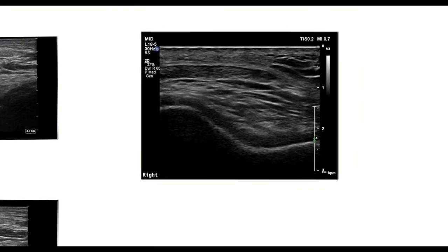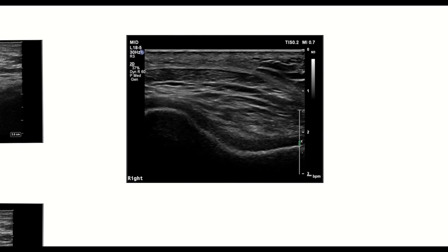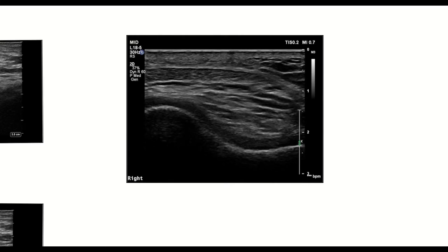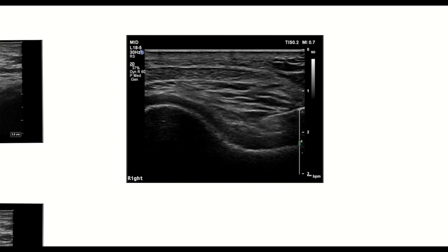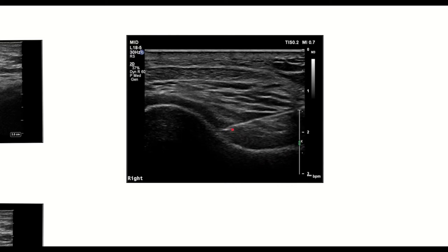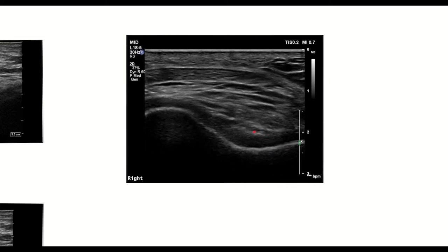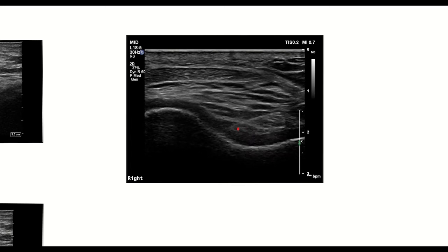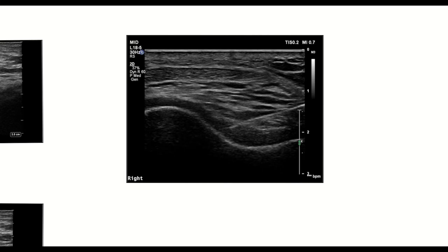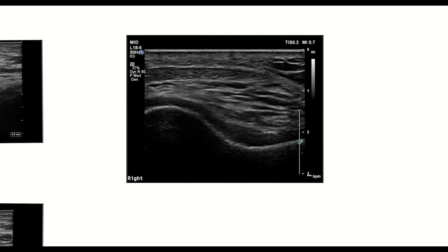Next, here is a 30-second clip of a right knee using a medial to lateral approach. The needle is coming in along the right side of the screen down to the articular cartilage — you can see the bevel quite clearly — and then the fluid is flowing just deep to the fat pad interface and just superficial to the cartilage interface. A little bit of air in the last portion of the injectate is released at the end.